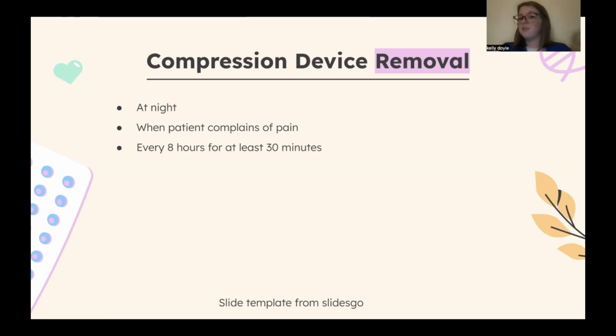So pay attention to your facility's rules and regulations, and also the order in the MAR. It might mention how long the doctor or the provider wants the compression device on. If the patient complains of pain or tingling, then there's something wrong and we need to remove the TED hose. And then a rule of thumb that our book mentioned is every 8 hours for at least 30 minutes. Again, this might change depending on facility, so don't use this as gold. It depends on the situation.